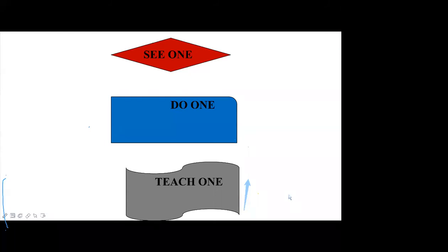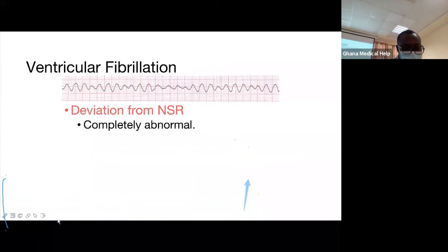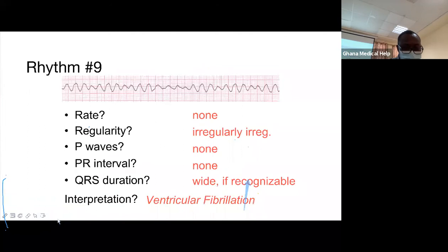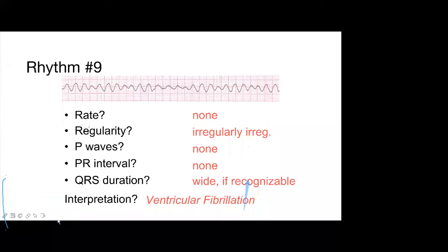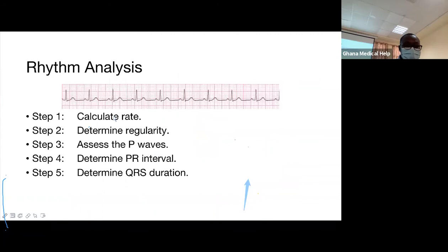Please, can you go back to the calculation of the rate? The rate, okay. I see that we really need to go over how to calculate the rate. You see, we really need to grasp the first step, the rate, because that's the key to opening the door. If you don't start well, you can't do the rest of the things.